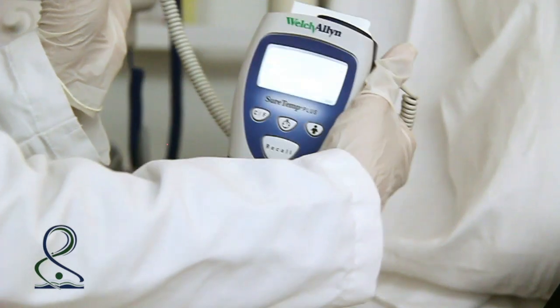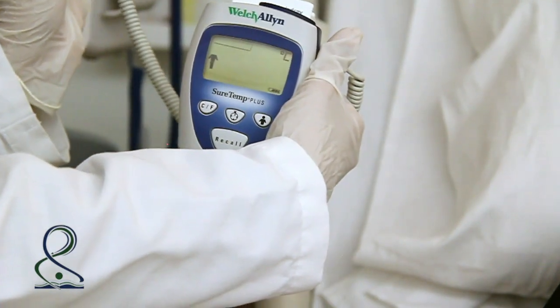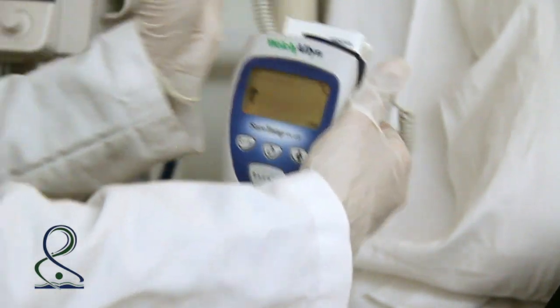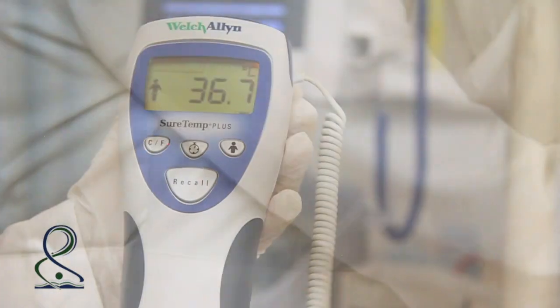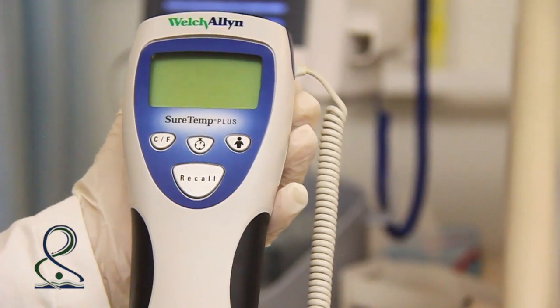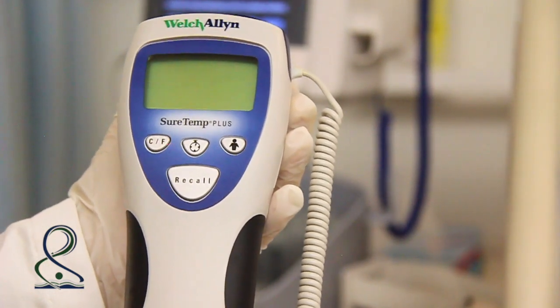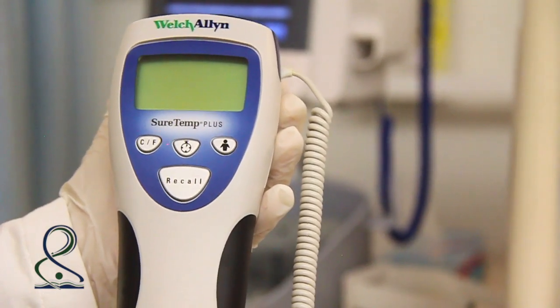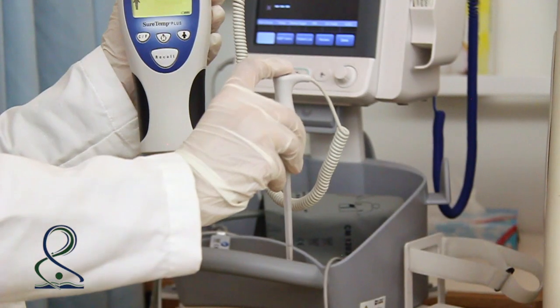Put the thermometer stick in the posterior sublingual pocket under the tongue. The temperature will appear on the screen. The normal range of temperature is between 36.4 to 37.4 degrees Celsius. Remove the probe cover.